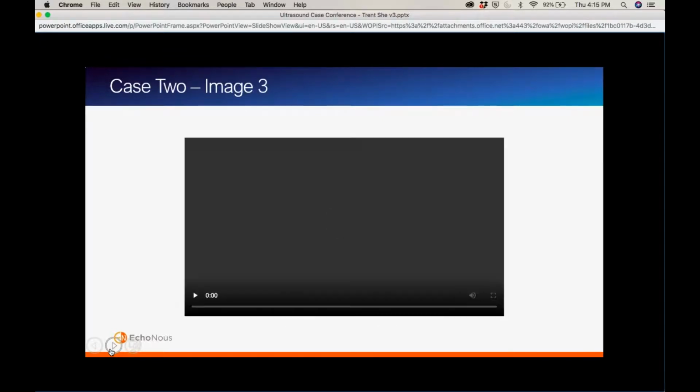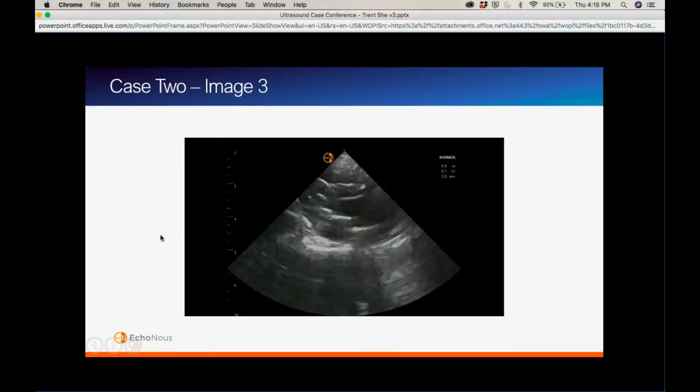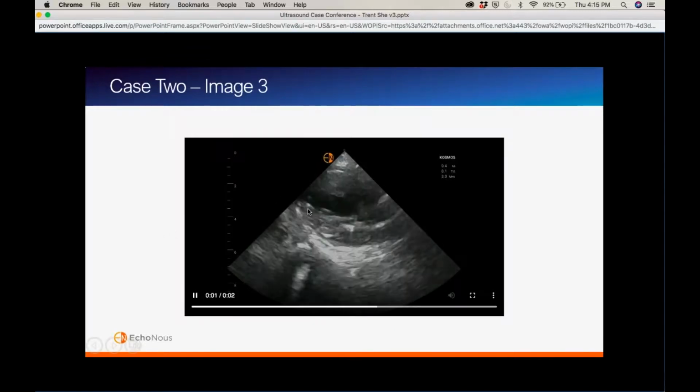Yeah, I feel like I tell the same thing to my residents, and here I am committing that sin, where you have this image and you're just like, oh, what is this? Yeah. So it looks like you're getting another view here.